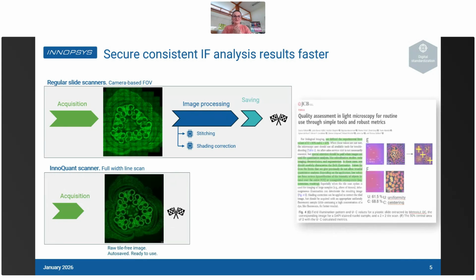And this is very important, especially when you want to do some image analysis and quantify or use a threshold to detect some positive objects, because this way you can be sure that the intensity of the pixel that you are analyzing is the raw value and there has not been any post-processing step, which is very important for use of threshold, because usually when we use a threshold, we decide on a positive value, and all pixels that are above this value are considered positive, but we need to make sure that these pixels are exactly comparable from one part of the image to another.